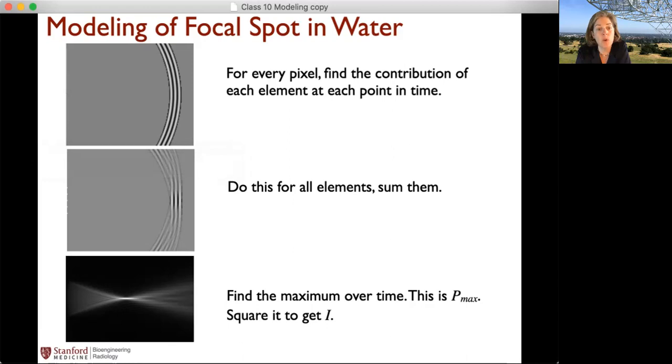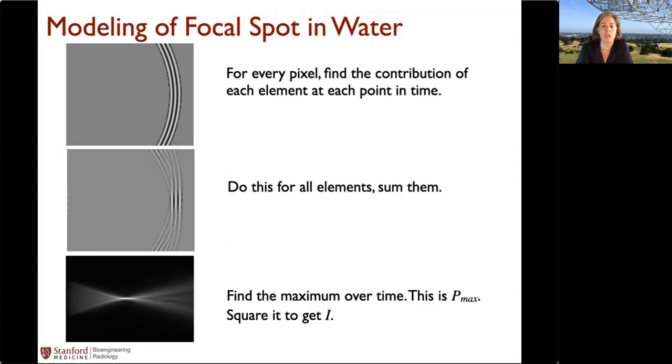And these are important images. There are lots of times you just want to know, what does the beam look like? So if you are thinking about what kind of ultrasound transducer you want, what your trade-offs are with the pitch and the frequency and the depth, the radius of curvature, this is a great way to do that.